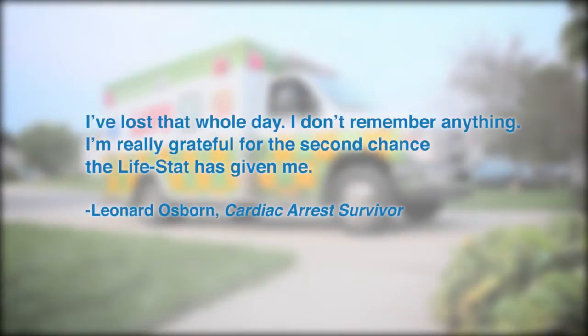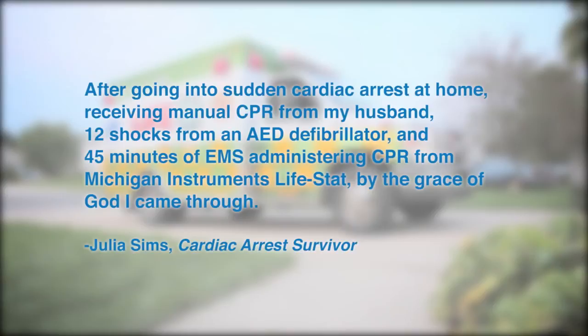I've lost that whole day. I don't remember anything. I'm really grateful for the second chance the Life-Stat has given me. After going into sudden cardiac arrest at home, receiving manual CPR from my husband, 12 shocks from an AED defibrillator, and 45 minutes of EMS administering CPR from Michigan Instruments' Life-Stat, by the grace of God, I came through.